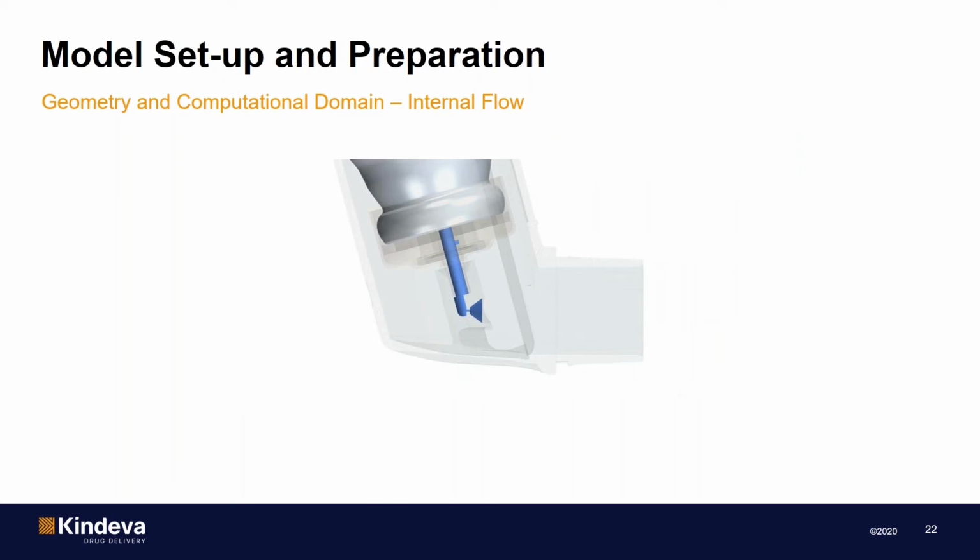So moving forward, we split the modeling in this work into two main parts, which are basically the internal flow and external spray sections. The purpose of the internal flow CFD model is to understand the precursors of liquid atomization inside a pMDI. And to do this, the first geometry domain of our model is basically the expansion chamber of a typical pMDI, which is the space formed by the valve stem and the actuator sump. We also consider the actuator orifice and the exit cone of the pMDI as well.